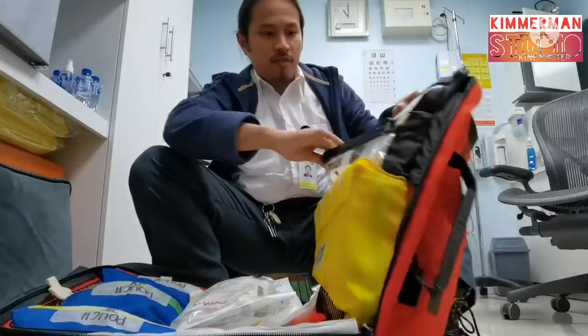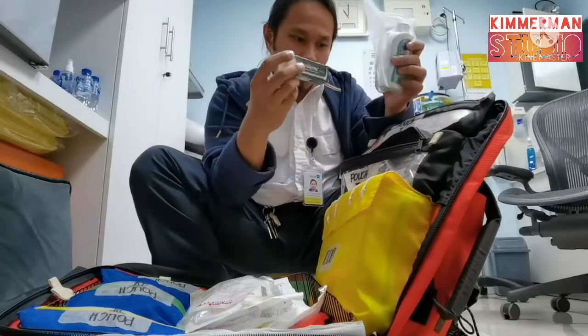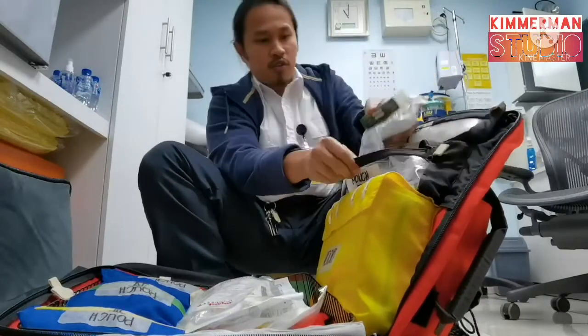Pouch two consists of a COVID-19 kit, antimicrobial cream, and an ice pack. It's complete.